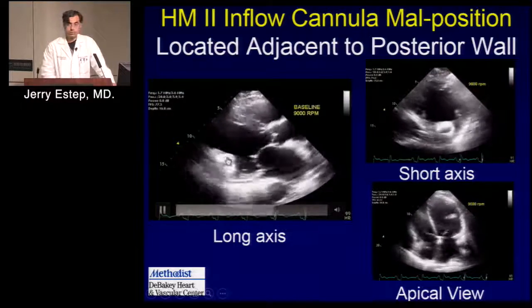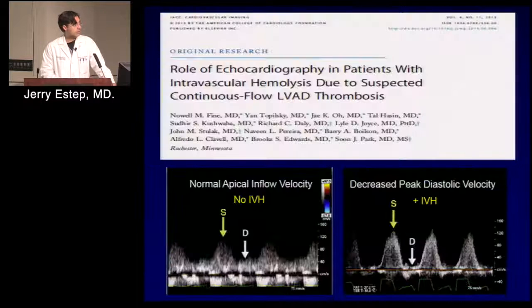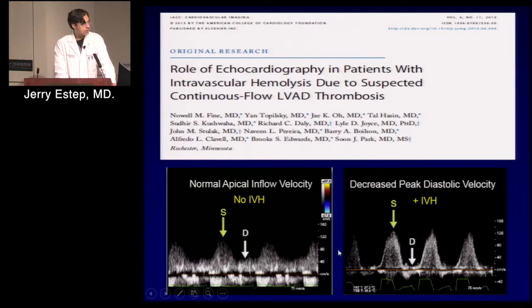In fact, you got tethering of the posterior mitral valve leaflet. So we're going to want a hint of inflow cannula positioning by echo. So you were asking me, and this is evolving. I showed this last year, but if you were to ask me the earliest sign of compromised pump function, you get a decrease in that background diastolic flow.